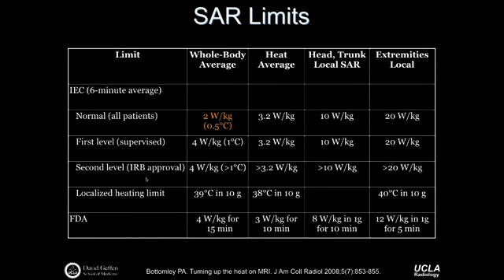From a practical perspective, another way of looking at this is the FDA limits. This is all for whole body, meaning what's the whole body's exposure. FDA limits it to about 4 watts per kilogram over a period of about 15 minutes. So again, there's a lot of guidelines in here as to what we can and can't do. The scanners are programmed such that they limit us from entering regimes that would result in too much patient heat.